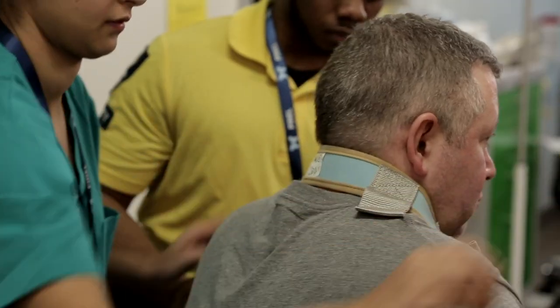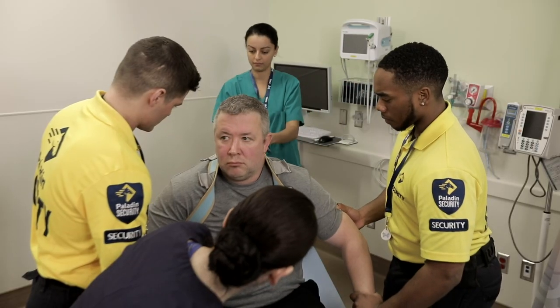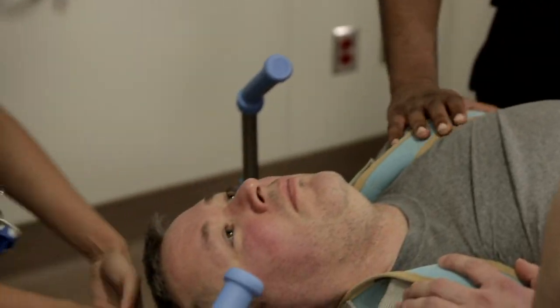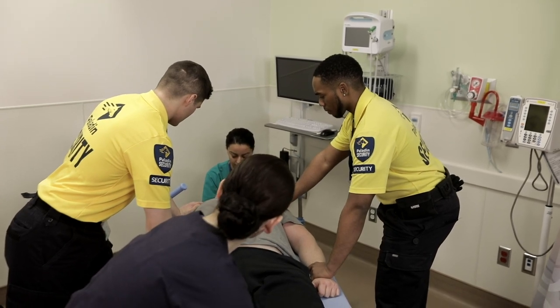Aim to place the white tab at the center of the strap into the nape of the neck. Toss the loose ends over the patient's shoulders. Reach under the patient's armpits and pull the straps backwards. If needed, use knee pressure with your full body weight to pull the patient backward.